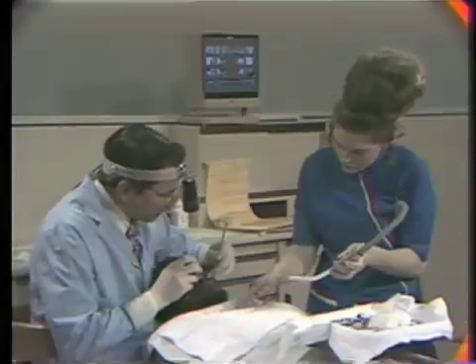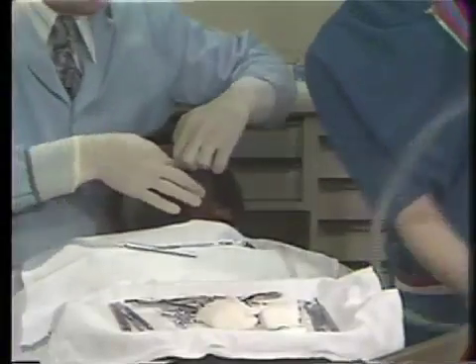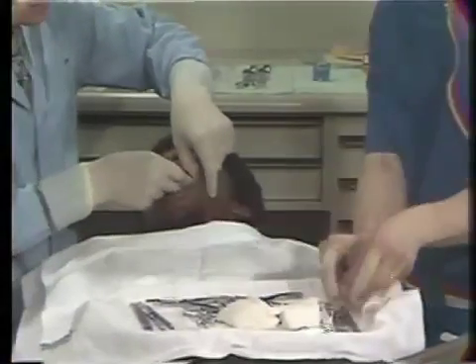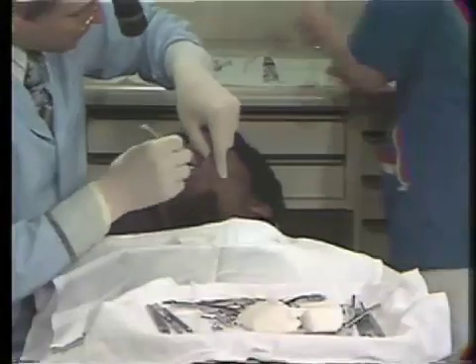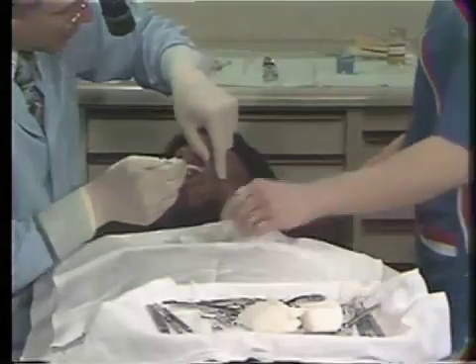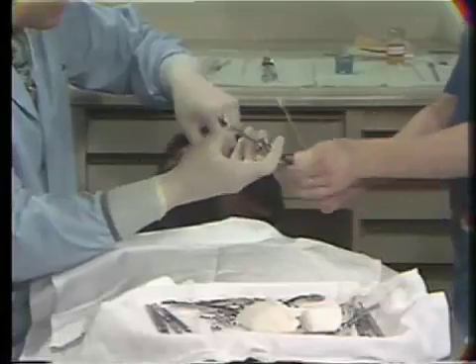And the next thing we'll need is the cotton-tipped applicators for the administration of the local anesthesia. She had this sponge ready and applicator. We're going to be doing this periodontal surgery in the maxillary left quadrant from the first bicuspid to the central incisor.